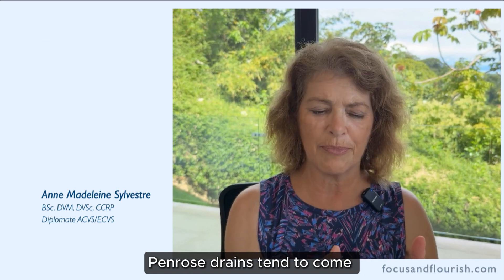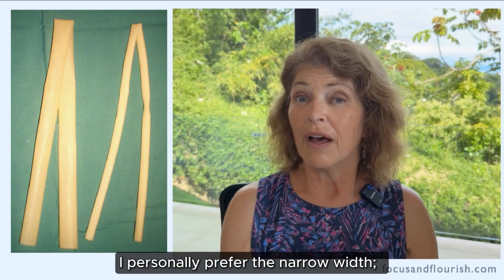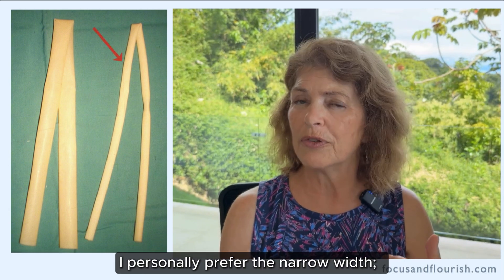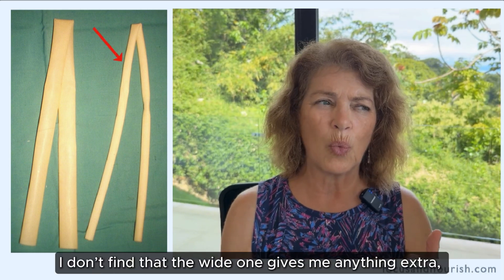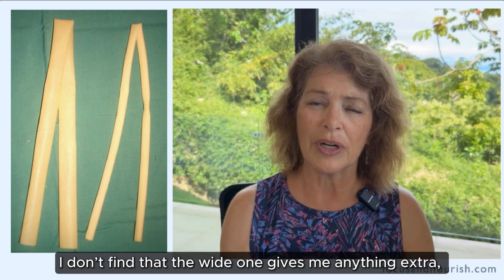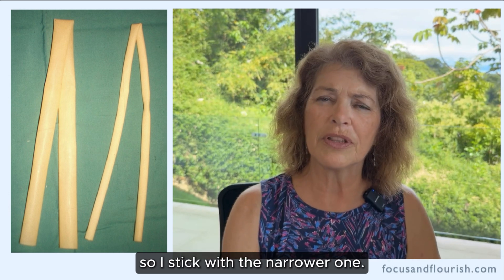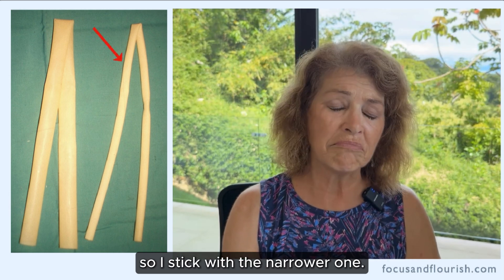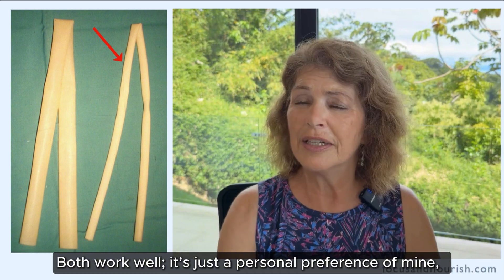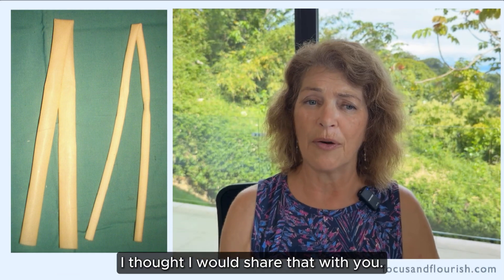Penrose drains tend to come in a narrow and a wider width. I personally prefer the narrow width. I don't find that the wide one gives me anything extra — it's just bigger and bulkier. So I stick with the narrower one. Both work well; it's just a personal preference of mine.